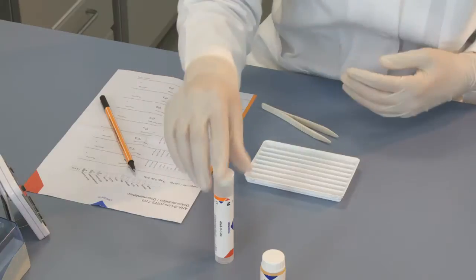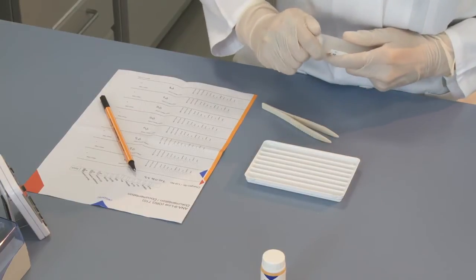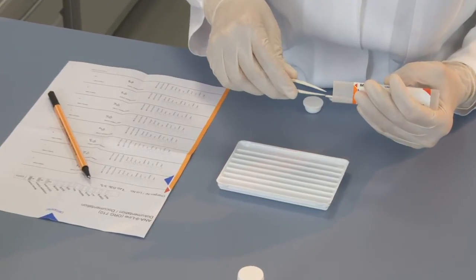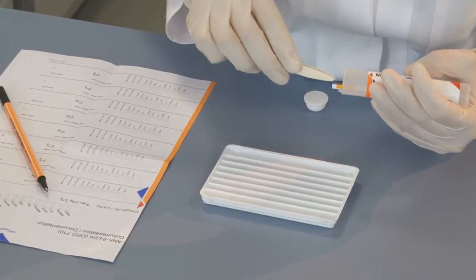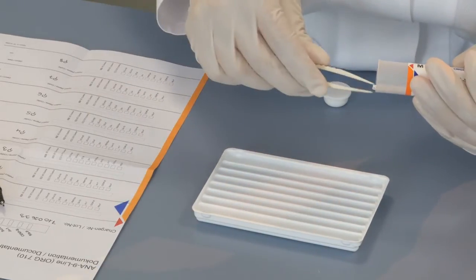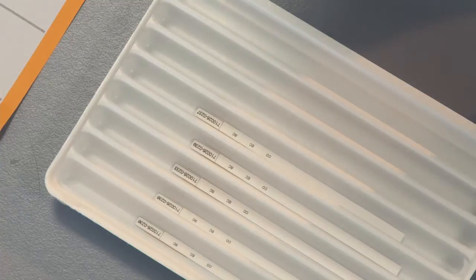To carry out a test, one strip is carefully transferred with tweezers to each compartment of the incubation tray. In order to obtain optimal results, the test strips must be placed in the tray so that the side to which the antigen is fixed faces up.